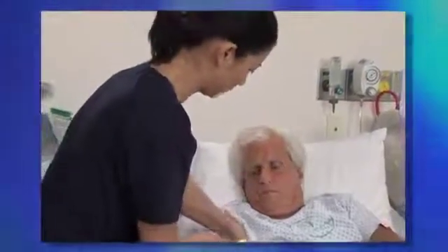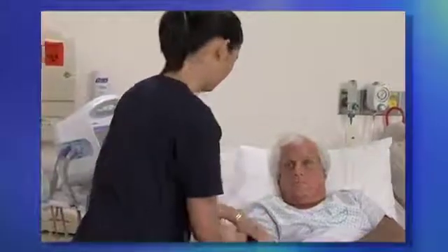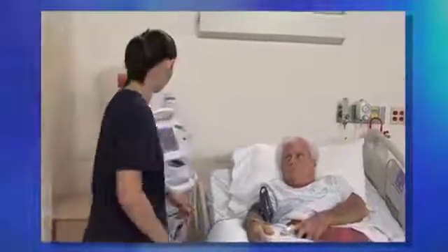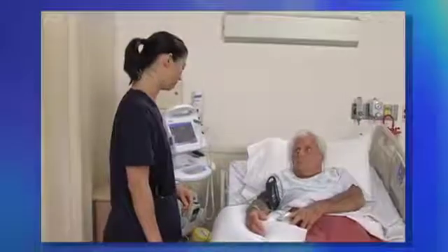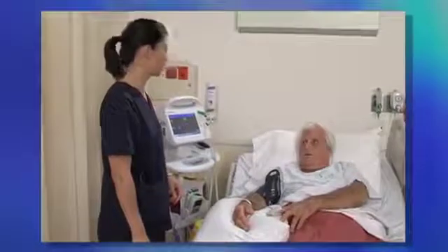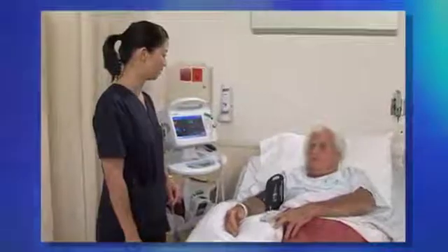The measurement and assessment of the patient's vital signs is performed routinely in every healthcare setting. Analysis of these findings through comparisons with previous measurements can indicate important changes in the patient's physical or emotional condition. To enable valid comparisons, it is essential that you measure vital signs accurately.